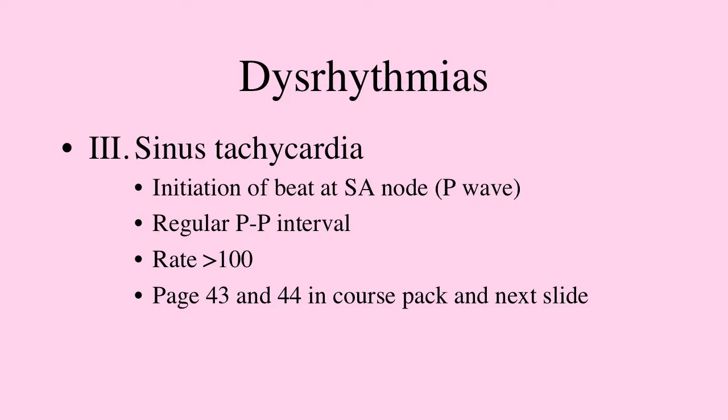In fact, sinus tachycardia is seen very often in babies, children, and also normally during exercise, whereas sinus bradycardia is often seen in athletes at rest because they just have a slow heart rate. Sinus bradycardia and tachycardia are generally not a problem. They're normal unless sinus bradycardia goes too slow, to where you're not getting good cardiac output, or if sinus tachycardia goes too fast to where you're not, again, getting good cardiac output. But usual mild forms of sinus bradycardia and sinus tachycardia are generally fairly normal.